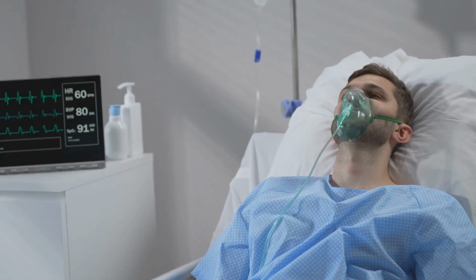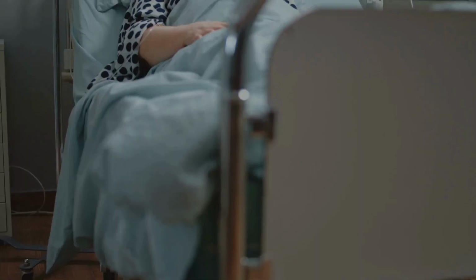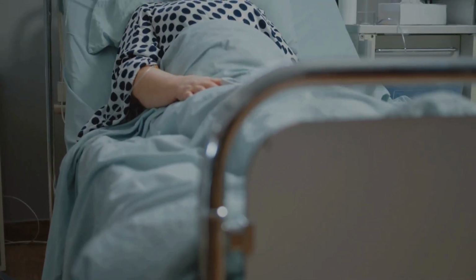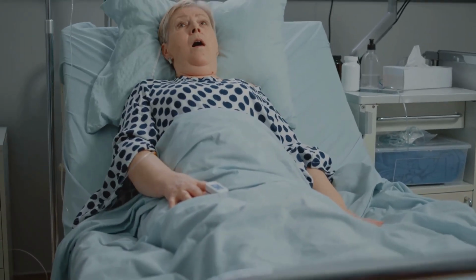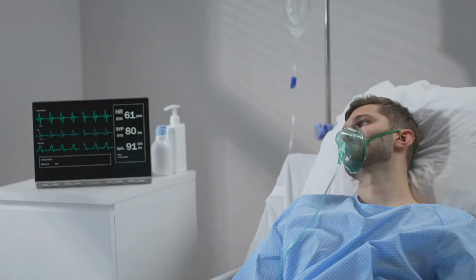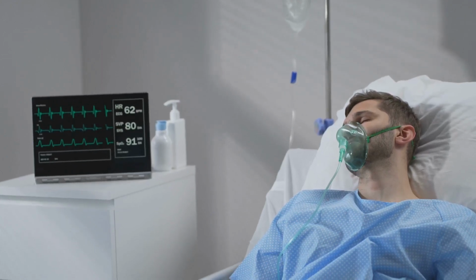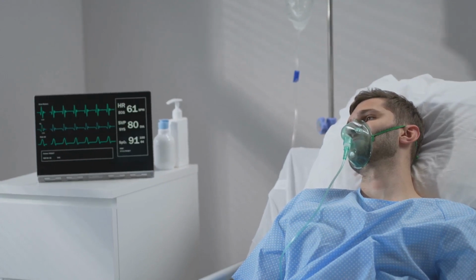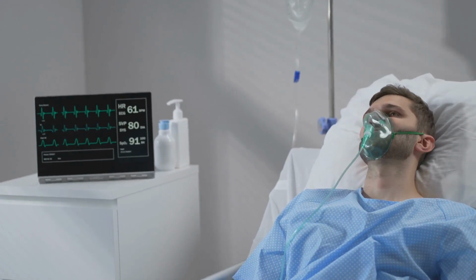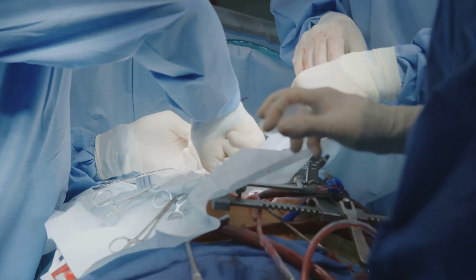Next, we delved into intubation while ventilating through an LMA using an ETT exchanger. This technique provides a clear pathway for the endotracheal tube and allows for ventilation throughout the procedure. However, it requires the use of a specialized ETT exchanger. Finally, we discussed intubation while ventilating through an LMA using an Aintree catheter. Similar to the previous method, it provides continuous ventilation and a clear pathway for the tube, but uses an Aintree catheter instead of an ETT exchanger.